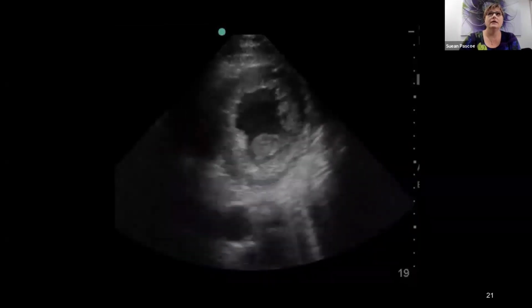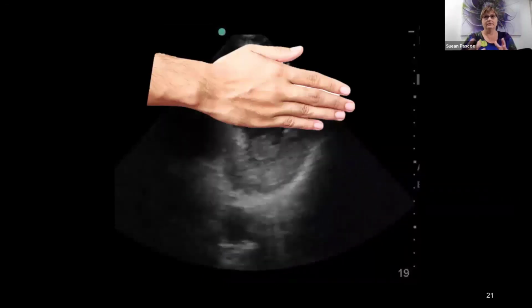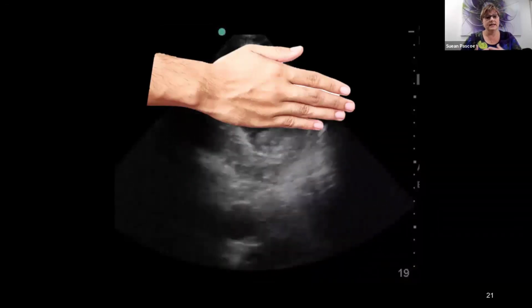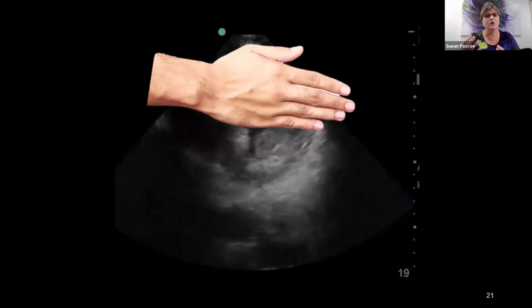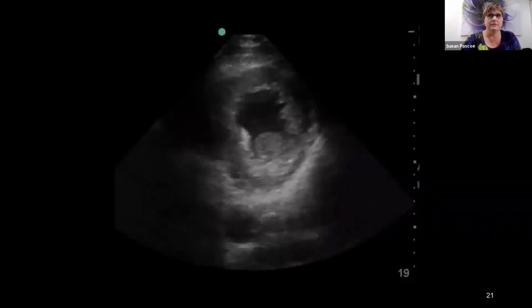So this looks all right. And then when we come down the bottom, you can see that it's not squeezing evenly towards the center as we're expecting. And as I said, I find if I cover up half the screen, it starts to help me figure out which side or which part of the ventricular wall is not moving, or to highlight that it isn't moving as I'm expecting.